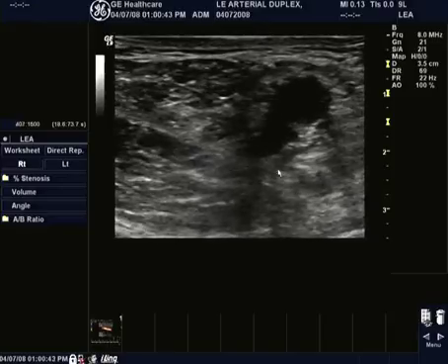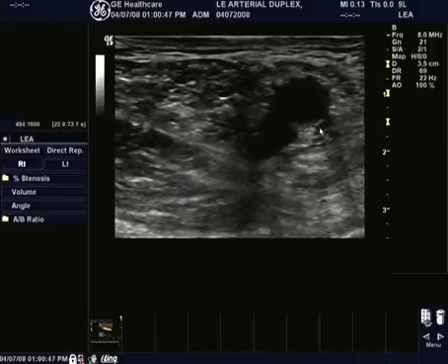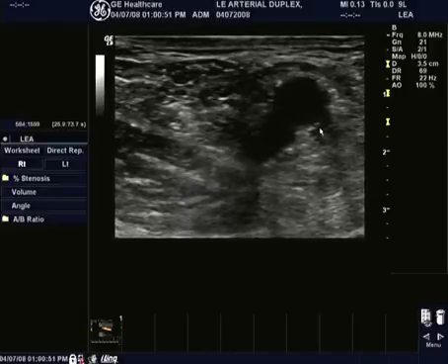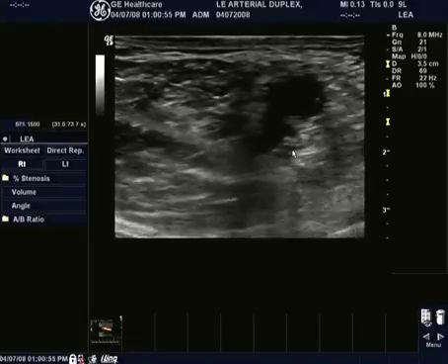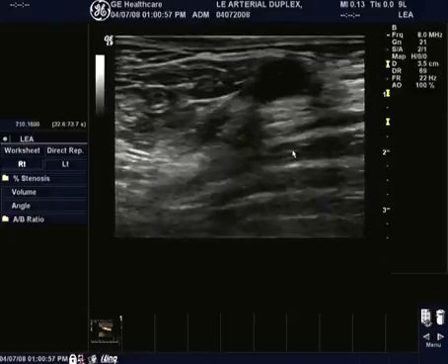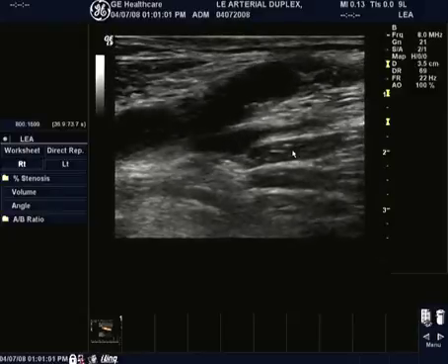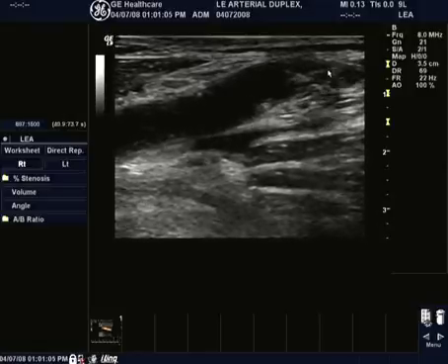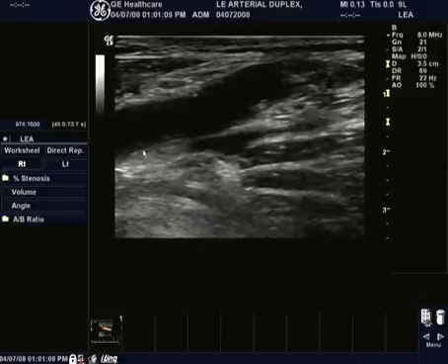And we see here up in the groin, one vessel here, and if I hold still, we can see that this one's beating, so we know that this is the artery, and obviously the artery should be lateral to the vein. If I go into a longitudinal view, we can appreciate the anastomosis of the bypass. Here's the bypass up here, coming in, coming down, and into the native artery.